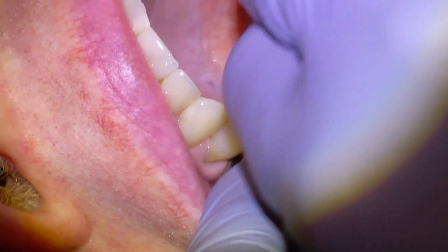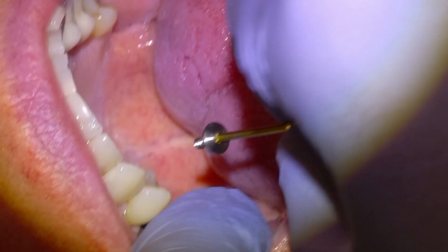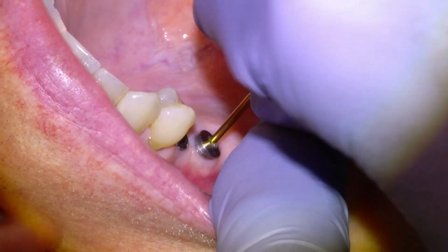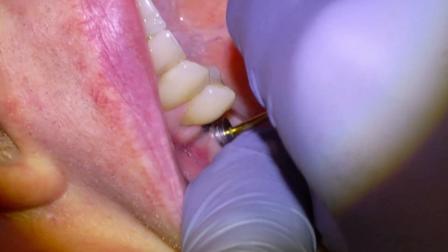Hey everyone, Dr. Tanner Dobson out of Nelson, BC here. In this video I'm going to be showing some footage of the installation of a dental implant bridge that we did this week. This was a patient that was referred to me to replace some teeth in his upper right quadrant, so we did that with dental implants. This is the kind of payoff appointment where we give him his teeth back.